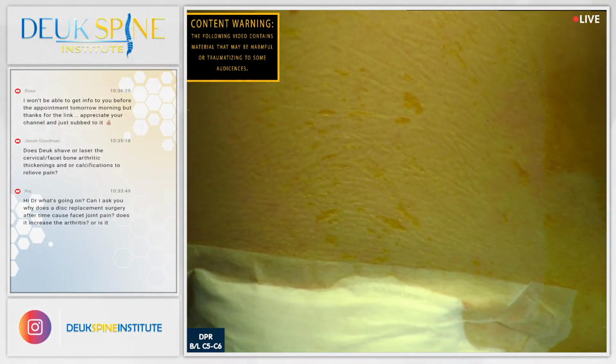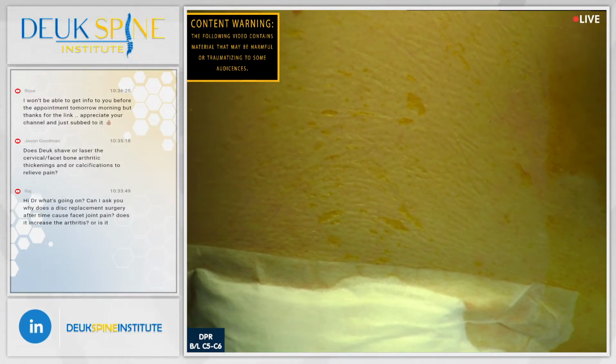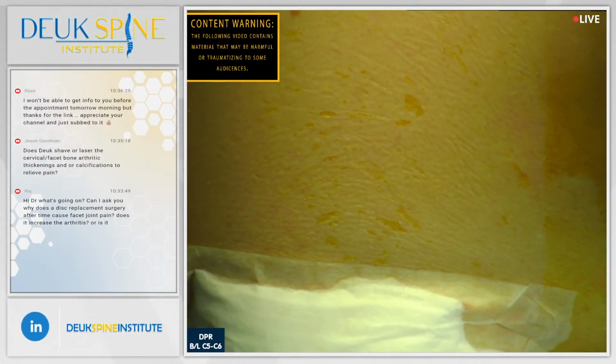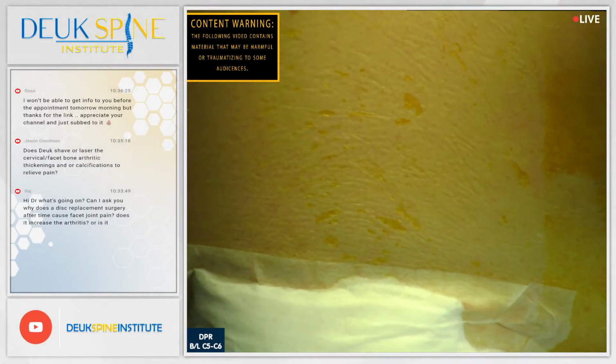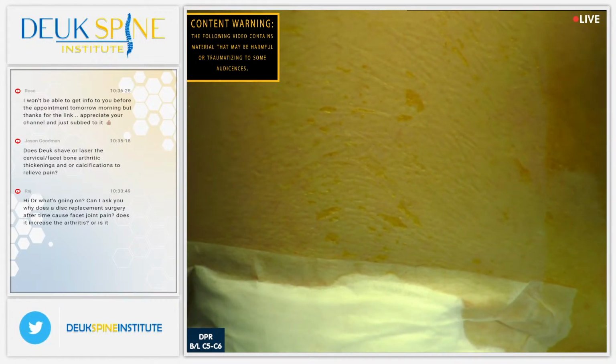That nerve has one purpose, and that is to carry pain from a painful joint up to your brain. You cut that nerve and you can have an absolutely normal life, no pain in your neck or back. It goes away immediately. There is a little pain with the procedure, but that goes away in a few weeks, sometimes a few months in different people. But there's no reason to shave anything down.